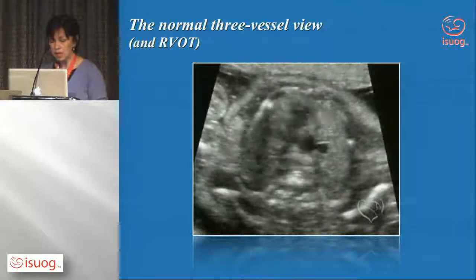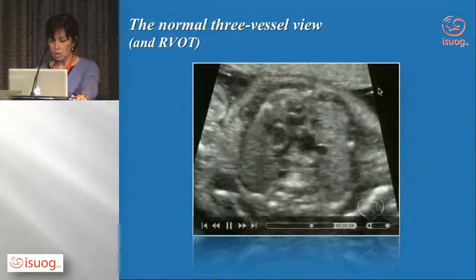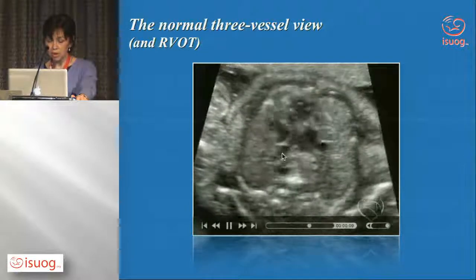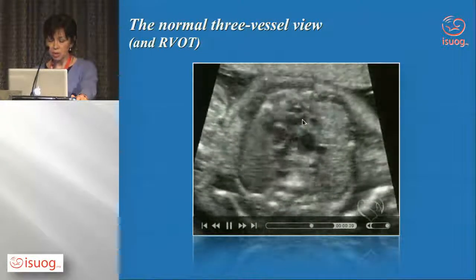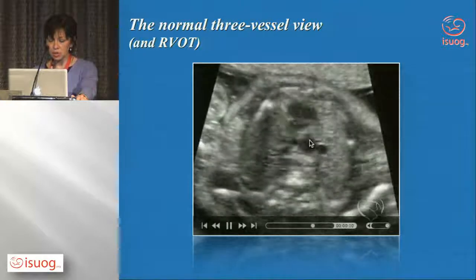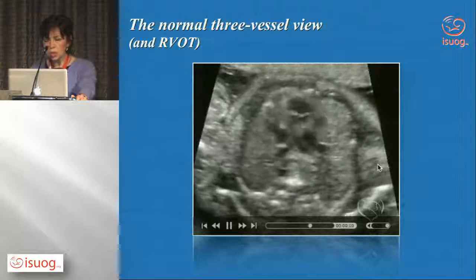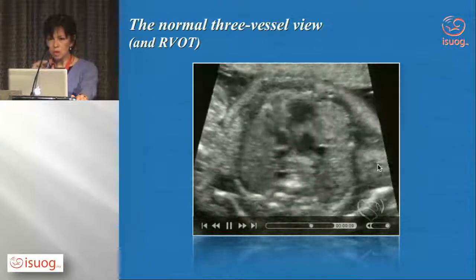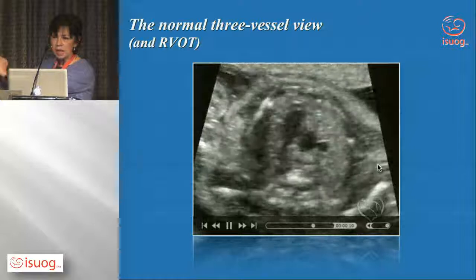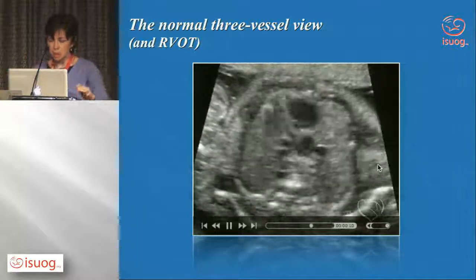And again, it's better to see that on a moving image. You can see that I can't get away from having my bifurcation there, the pulmonary valve. That's the pulmonary artery, the aorta, and the superior vena cava. So I like to show this very slowly so that you appreciate it. You can't really go like you go, this is an arm and this is a hand, because they're a long distance. These are very, very short distances.